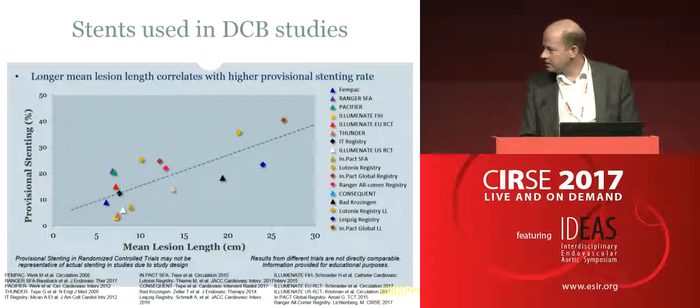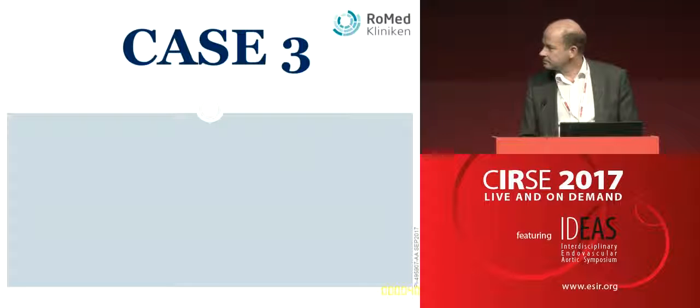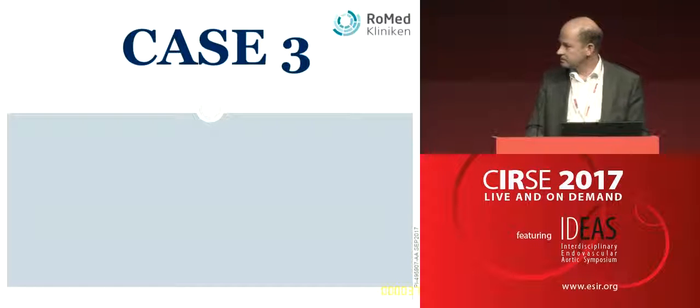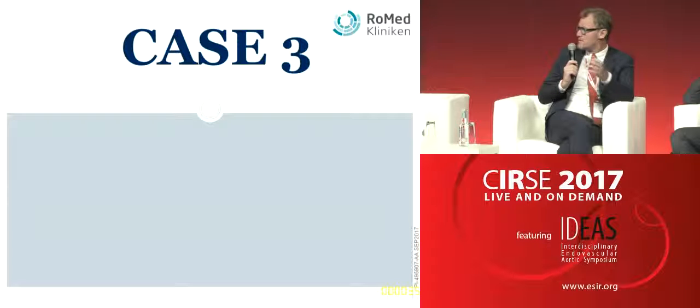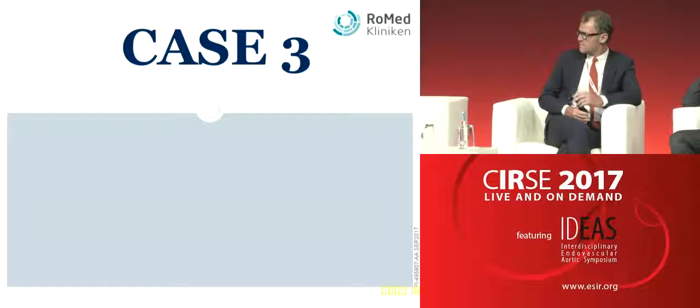I have a question for everybody. When you perform a vessel prep or DCB treatment, how do you assess the results? In a randomized clinical trial, we perform a different view, perhaps a duplex scan. Do you perform a different view or a duplex scan in routine practice to assess the results of a vessel prep or DCB treatment? We did different angulations and looked from different views. So that was the way we addressed that issue.